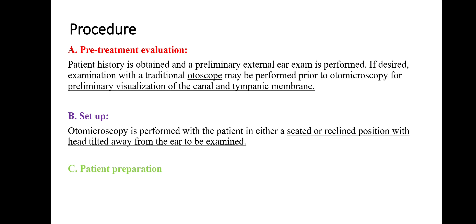Procedure — Pre-treatment evaluation: Patient history is obtained and a preliminary external ear exam is performed. If desired, examination with a traditional otoscope may be performed prior to otomicroscopy for preliminary visualization of the canal and tympanic membrane. Setup: Otomicroscopy is performed with the patient in either a seated or reclined position with head tilted away from the ear to be examined.